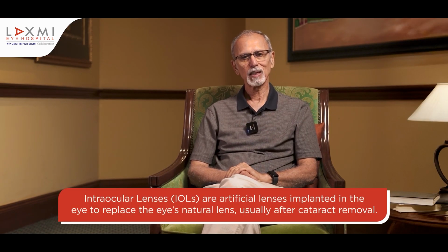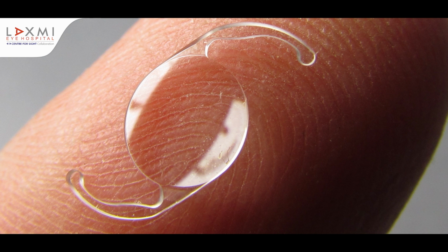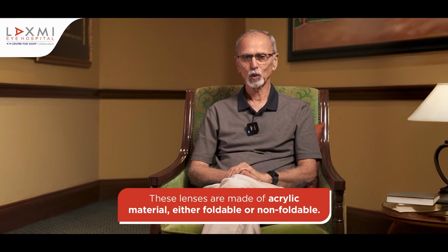Intraocular lens implantation is part and parcel of cataract surgery. Like today, when you get operated for cataract, it is understood that the cataract is replaced by an intraocular lens. Intraocular lens is made of an acrylic material, and it is either non-foldable or foldable.